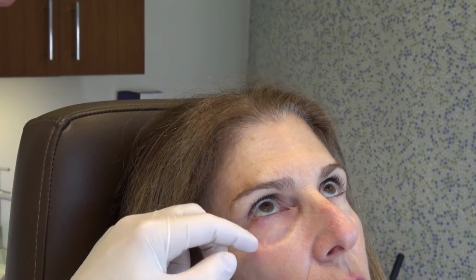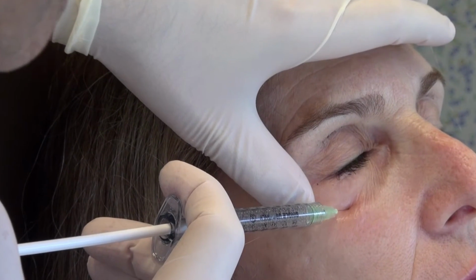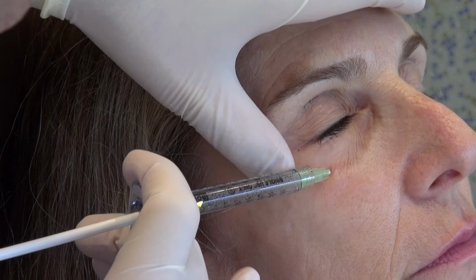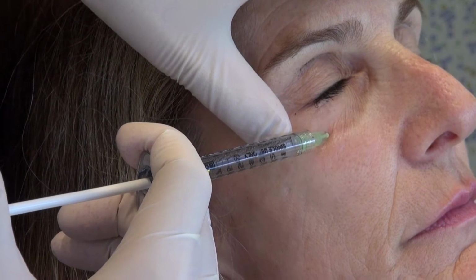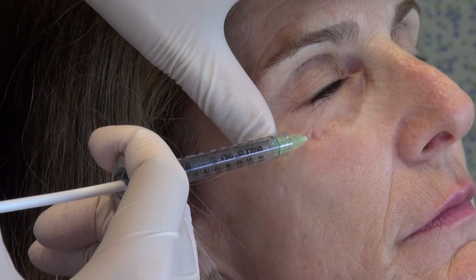Okay, so let's start from over here. Go ahead and close your eyes. I will place the needle through the skin, hit bone, pull back, reposition the needle. I'm now in the very deep layer, right on top of bone, and then I'm going to put a little stripe of filler on top of that area.